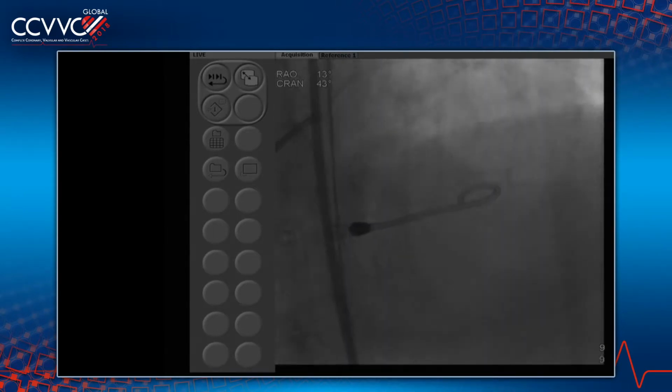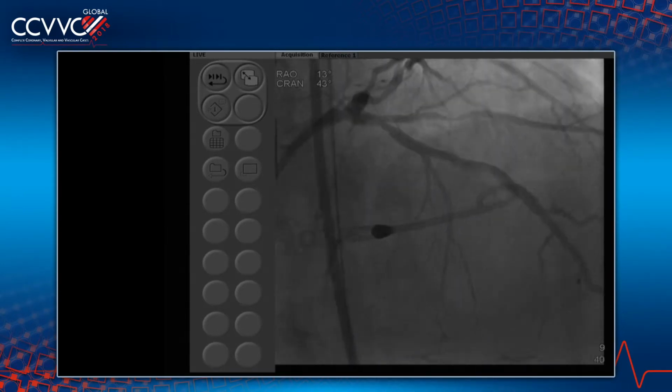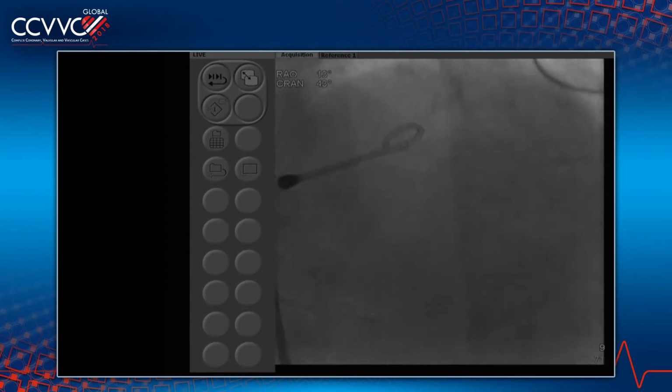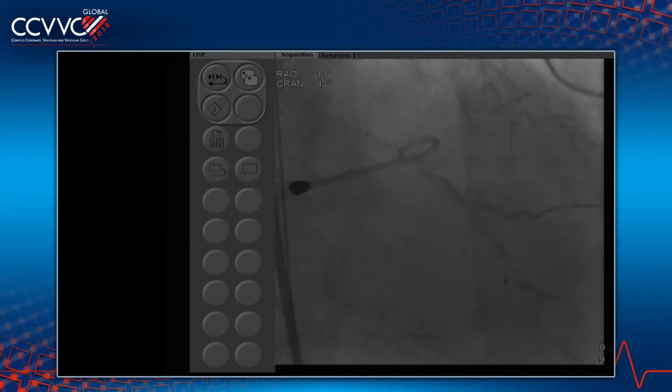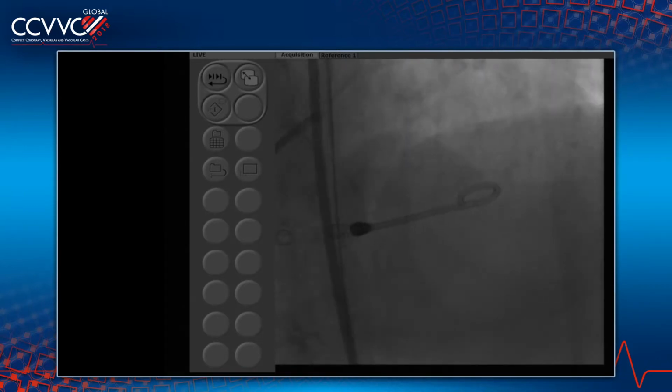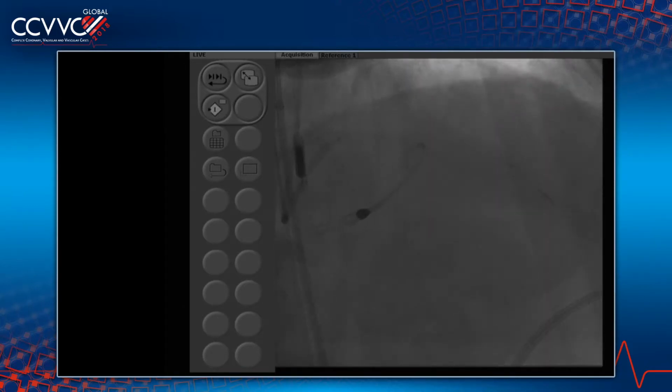As well, and I'm worried about too much dye. Although they didn't use much dye here. We just saw that. They did a really good job with very little dye. Yes, Chad? It's very interesting when you look at the creatinine after those types of procedures, it often goes down because of the higher flow during the procedure. That's right, the better flow.